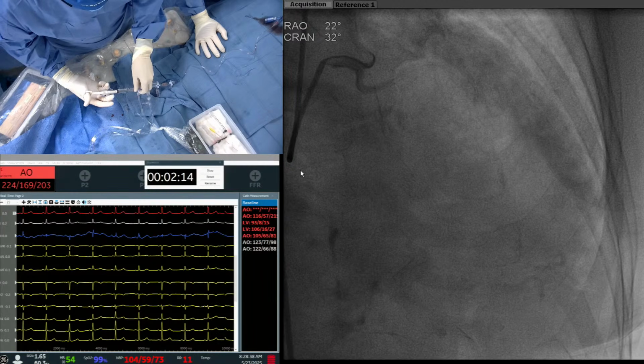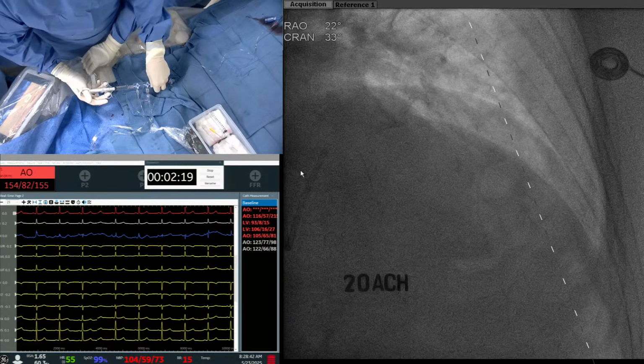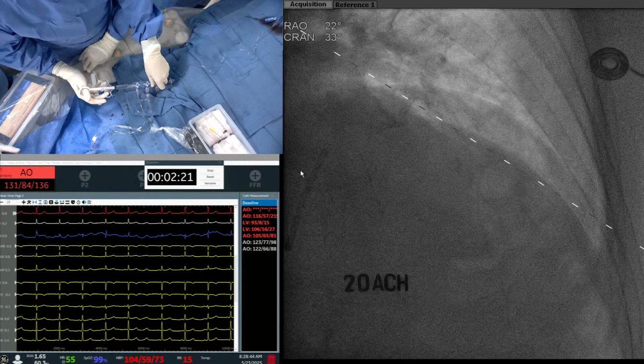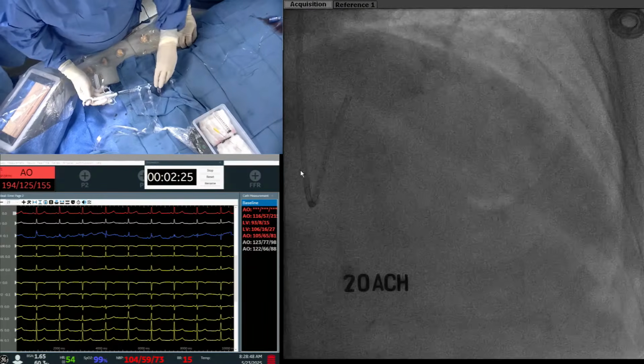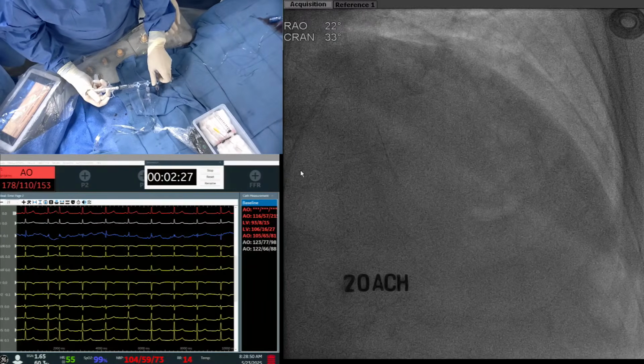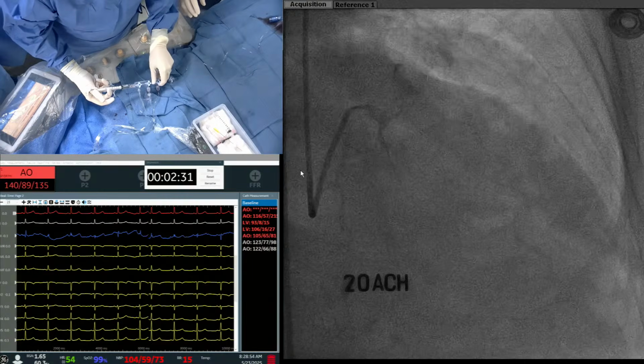And what's your sedation strategy for the patient? Do you keep them awake or are they sedated? So we'd love to have patients awake, but we do provide sedation through fentanyl and Versed in that combination. Yeah, we do the same, and I don't think it's changed our yield of spasm. We still see quite a bit.